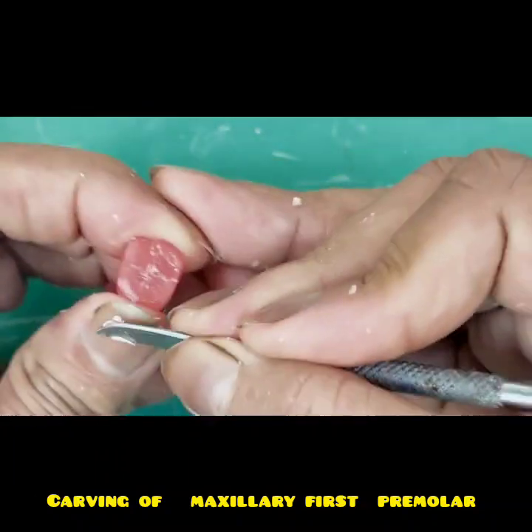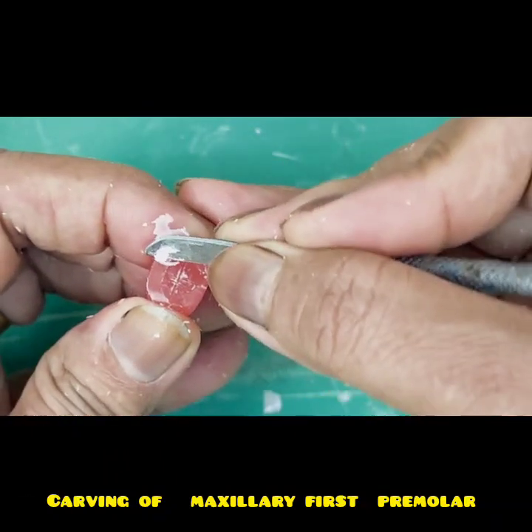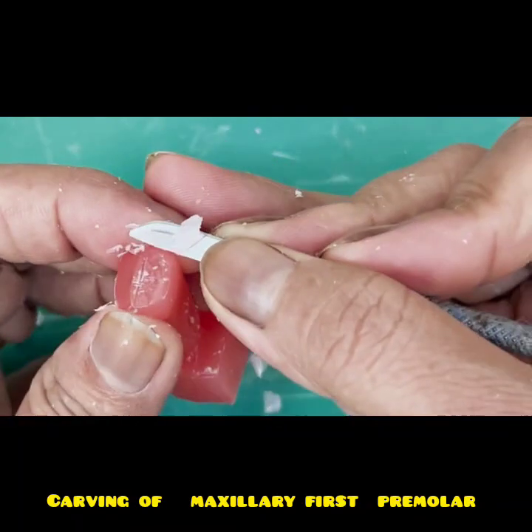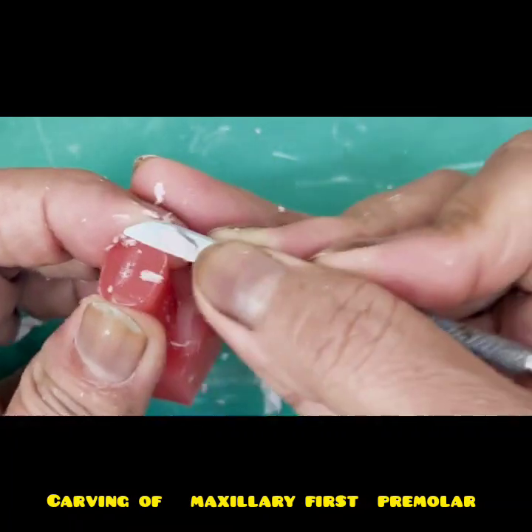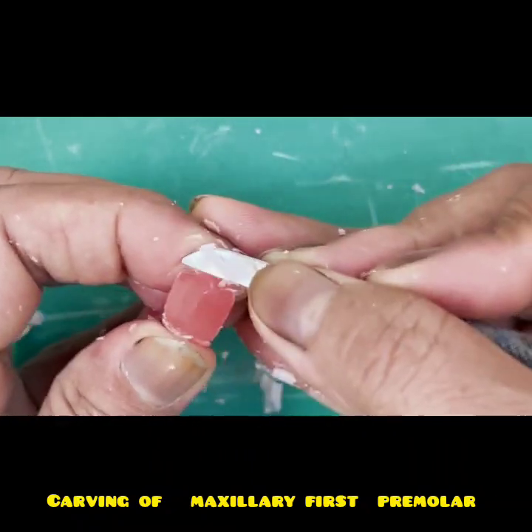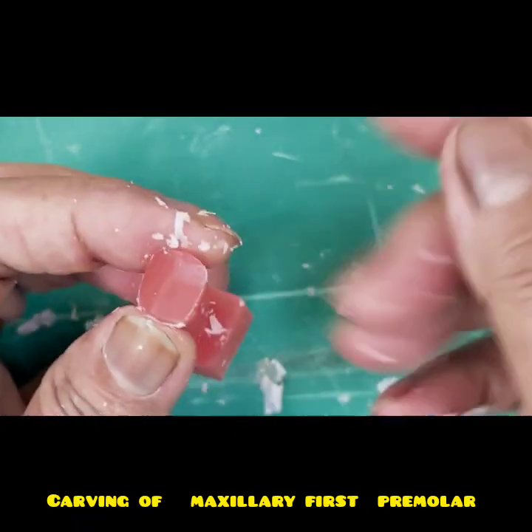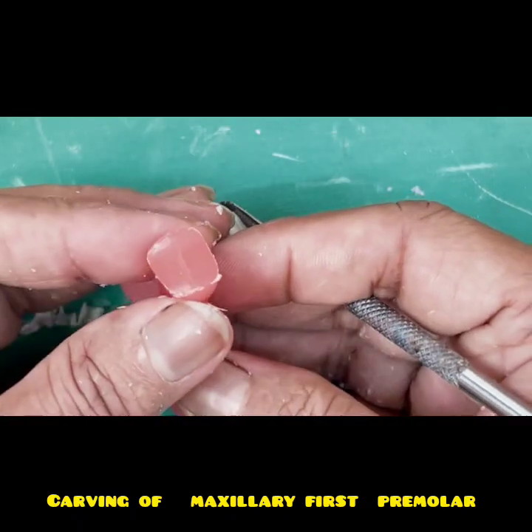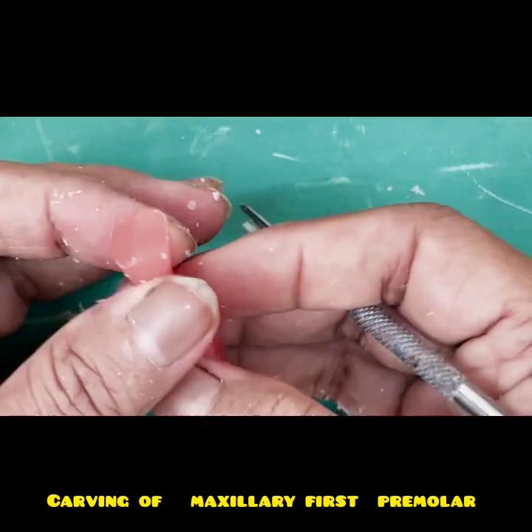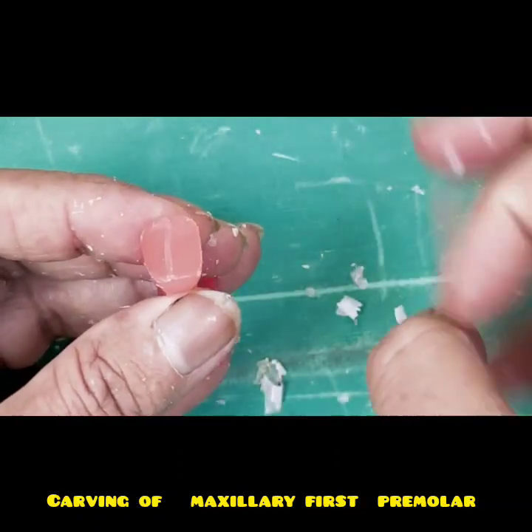the roof of the hut. I am keeping my carver at an angle on one half of the occlusal surface and converting it into inclined planes, and it should not be too much, a little sloping from the imaginary horizontal plane. Now you can make out my occlusal surface has become inclined and resembles the roof of a hut.